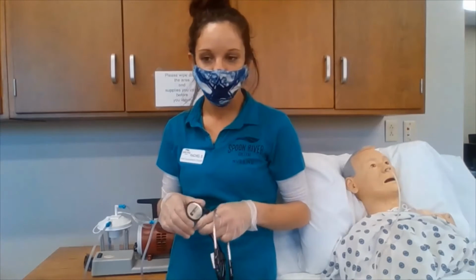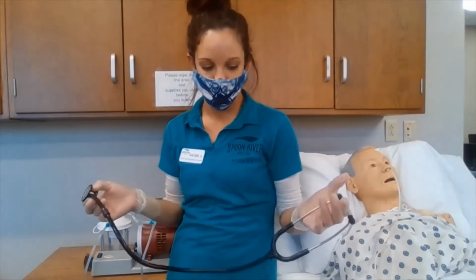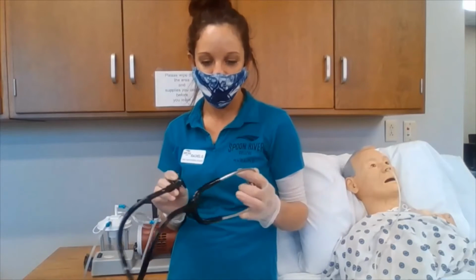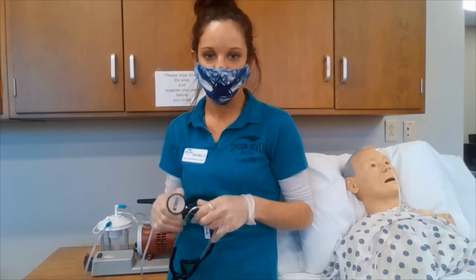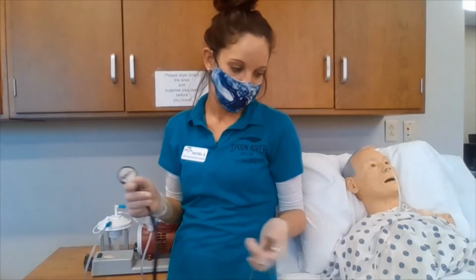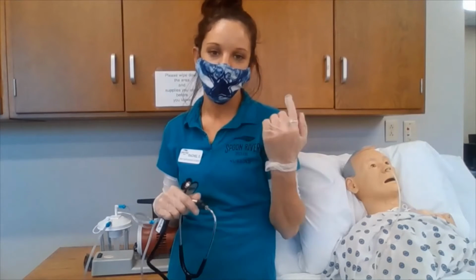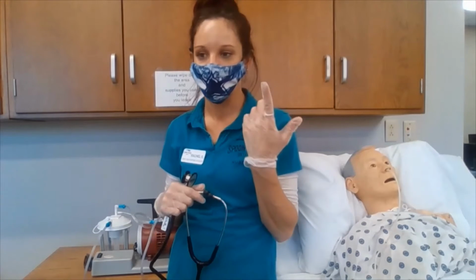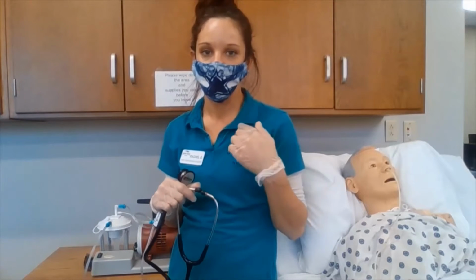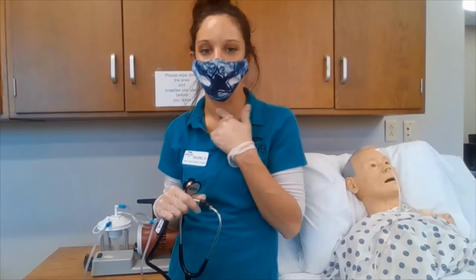Other than the initial x-ray that our patient will be given before any kind of administration through the tubing is performed, there's a few bedside verifications of placement that we can also do. So number one, of course, is inspecting the back of the pharynx to make sure that there's no presence of the tube coiling.